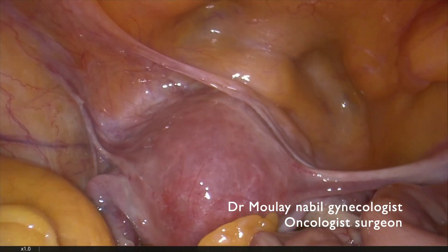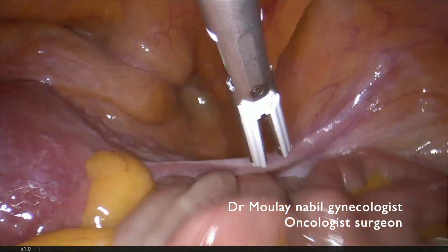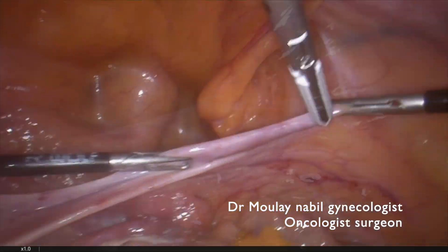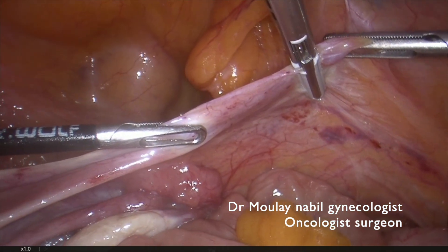This is the management of endometrial cancer in an obese morbid patient. You can see we fight with the bowel to see clearly our operative field.